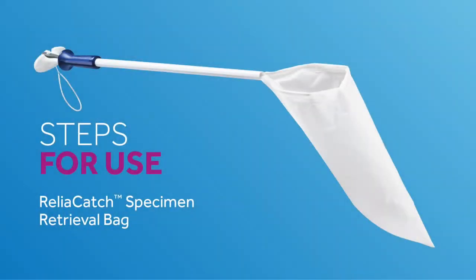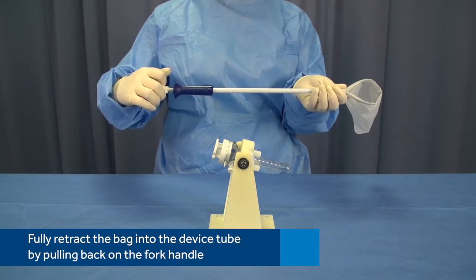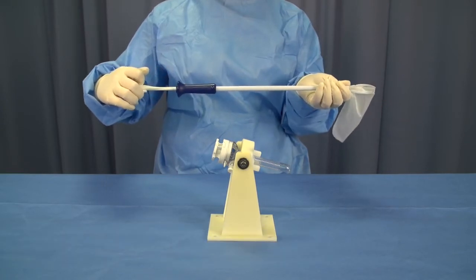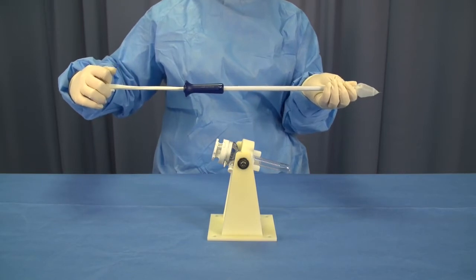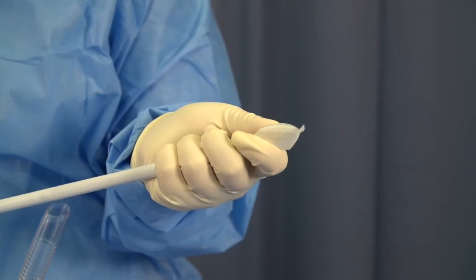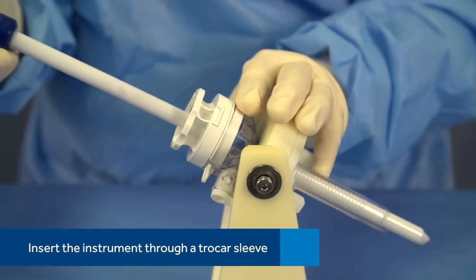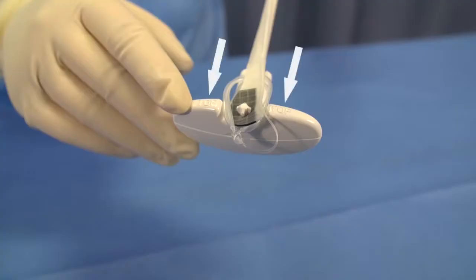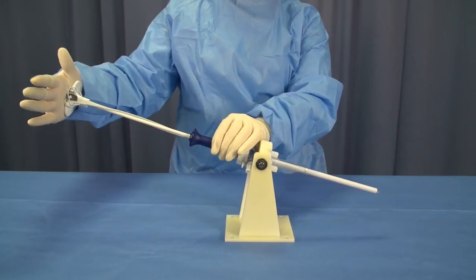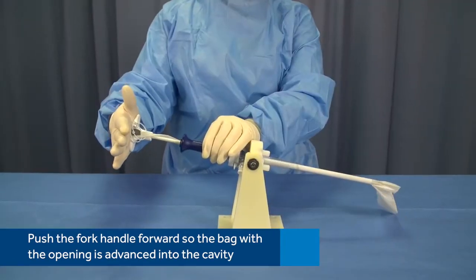Now let's see how the Reliacatch Specimen Retrieval Bag is used. Fully retract the bag into the device tube by pulling back on the fork handle. Do not pull the fork handle assembly completely out of the device. Gently release trapped air from the specimen bag prior to full retraction by compressing the bag during retraction. Insert the instrument through a Trokar sleeve. Look at the visual indicators on the fork handle to orient the bag during deployment. Using caution, push the fork handle forward in a plunger-like fashion so the bag is advanced into the cavity.